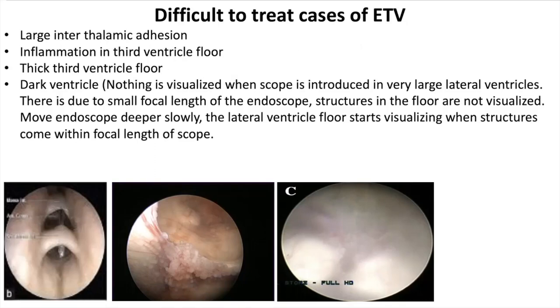Difficulty can also arise in dark ventricle syndrome when the scope is introduced into a very large lateral ventricle, because of the small focal length of the endoscope — the structures in the floor of the third ventricle are not visualized. The solution is to move the endoscope slowly deeper into the lateral ventricle until the structures come within the focal length.